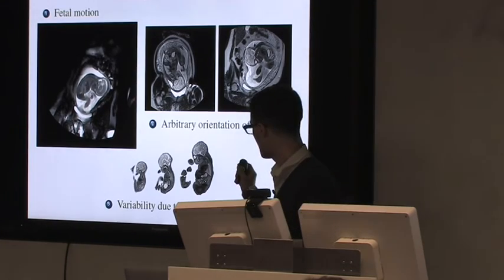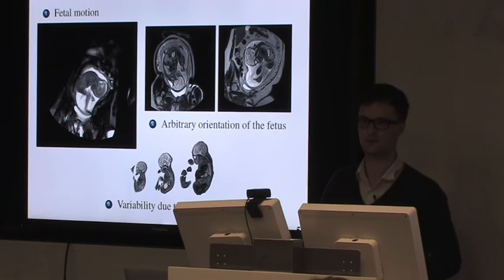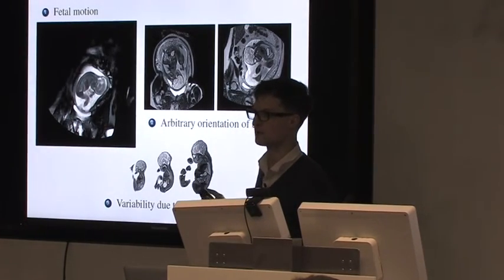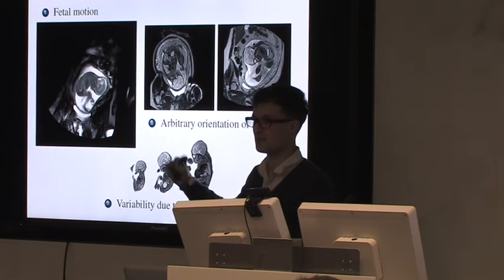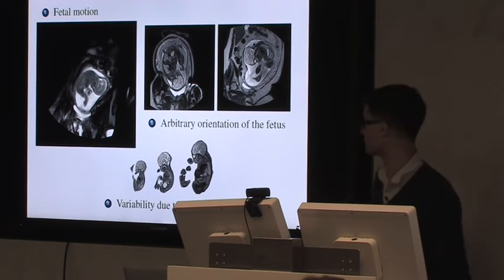And also, you can use MRI on the fetus from 20 weeks to 40 weeks term. That's at 20 weeks, and that's at 40 weeks, so you've got a 50% increase in size. All the organs are the same, but the relative size, the contrast patterns, things are different, so that's the complexity I have to deal with.